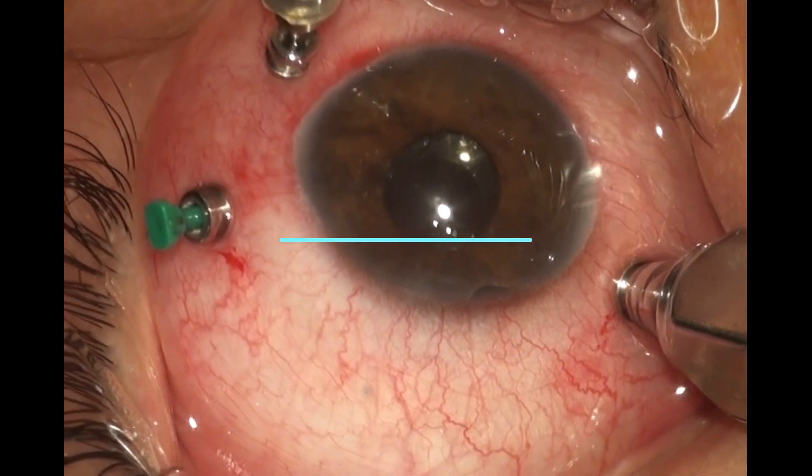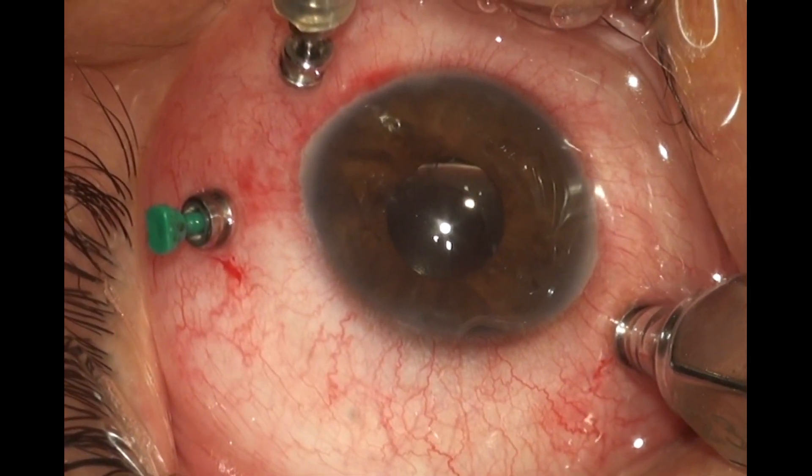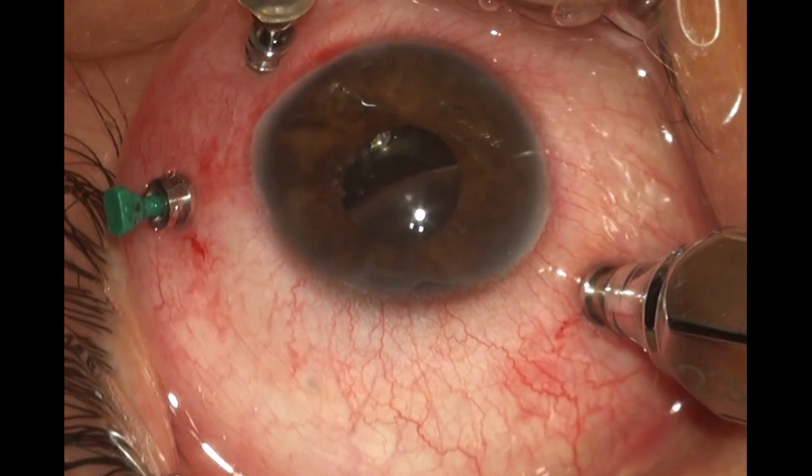Hi guys, today we deal with a case of recurrent retinal detachment repair. This can be a retinal surgeon's worst nightmare, but it still has to be dealt with.